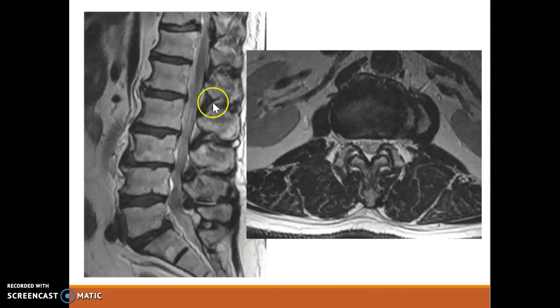Looking at this one, this looks like a pretty rubbish MRI scan. You're looking at wedging of T12 there. Again, it's not sitting nice and square. You've got some wedge fracture there, but it's not compromising the neurological aspect. There are no issues with it protruding onto the spinal cord. You've got some signs of degeneration, some hypertrophy of the facet joints here. But again, there's nothing there that you wouldn't expect within a normal degenerative spine.